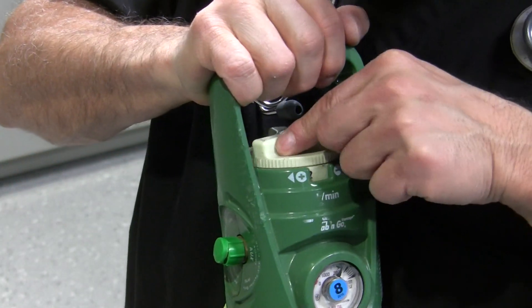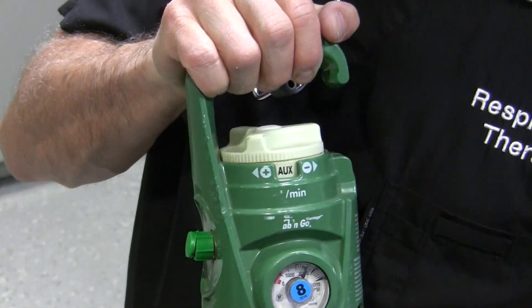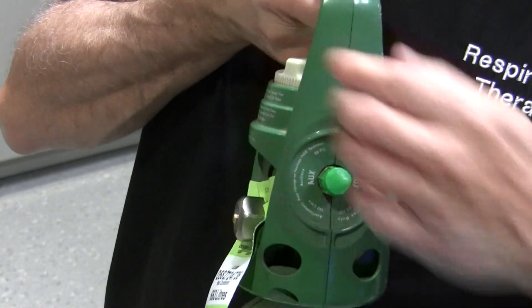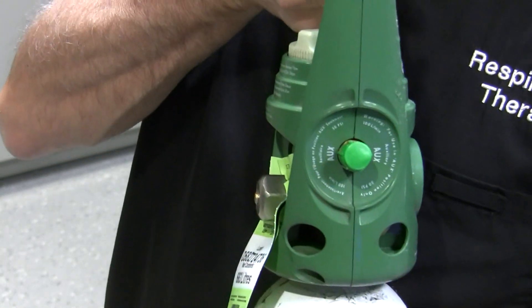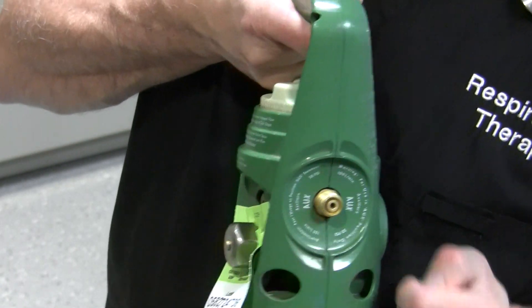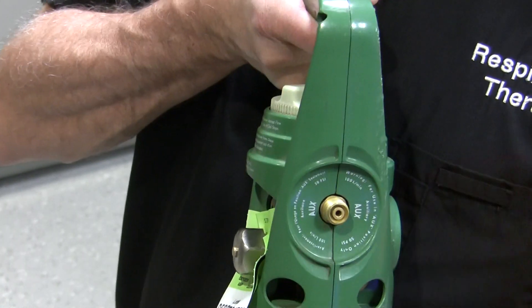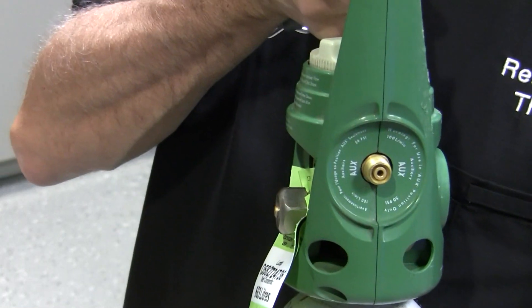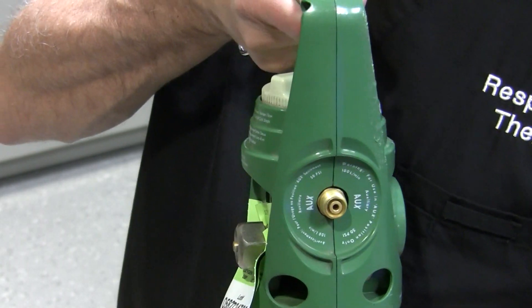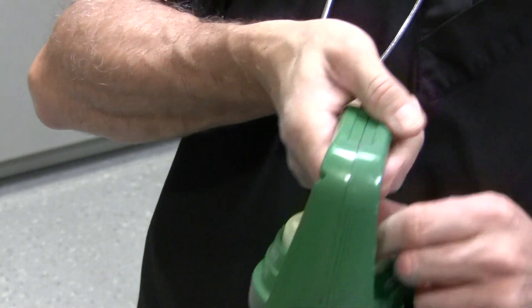There's also a setting called auxiliary. What auxiliary indicates is that if you need to hook up a high pressure hose — going to a ventilator or something like that — you take this cap off and there is a DISS oxygen connection. You can hook up a high pressure hose to this connection and have this tank power a ventilator, or any other equipment that requires a 50 psi oxygen source, like a high flow blender or something of that nature.